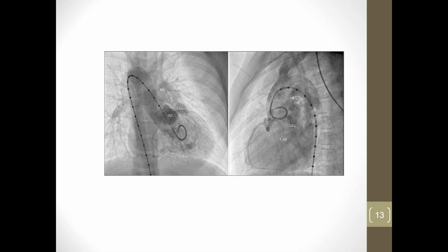They normally go up with a general catheter, put some contrast up into the heart, and then find out where the obstruction is. Then they have specialized catheters that they come back with to fix the problem. So by having those little markers on there, it shows up real easy on the X-ray and gives them an idea how far they are in the artery and how far they need to go to do their interventional work.